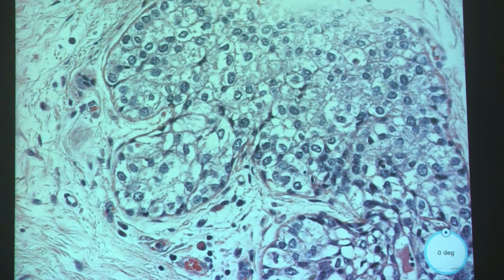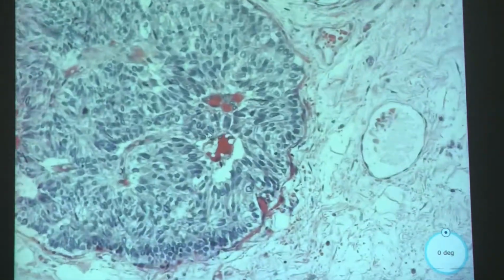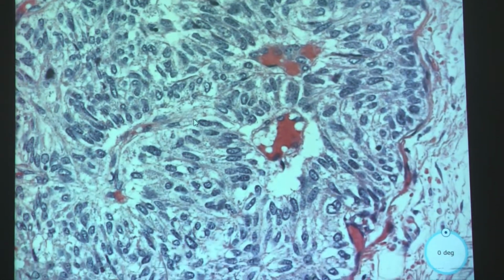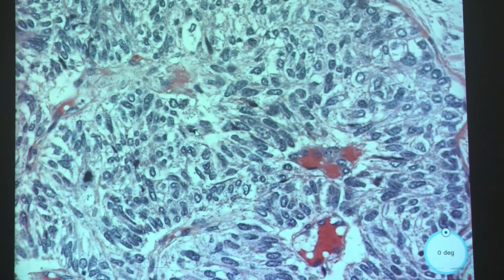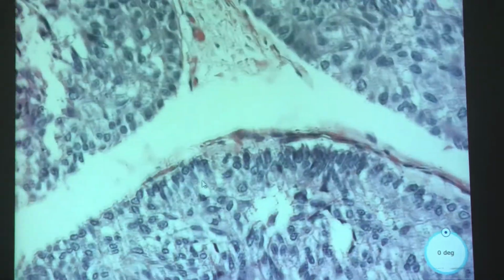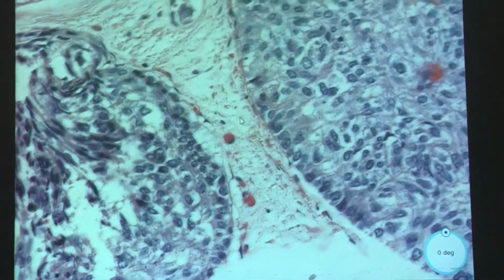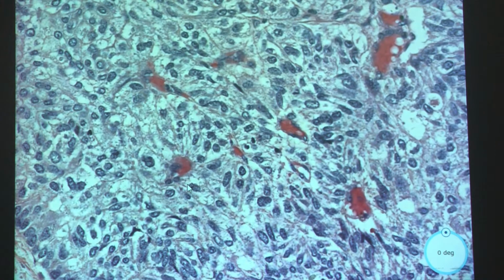Look, it looks a little clear. How about the nuclei? Oh, wait, no, this is not the spindly. It's not really behaving too much, and it doesn't have to have this differentiation, because there are spindle variants, which this might have more of.